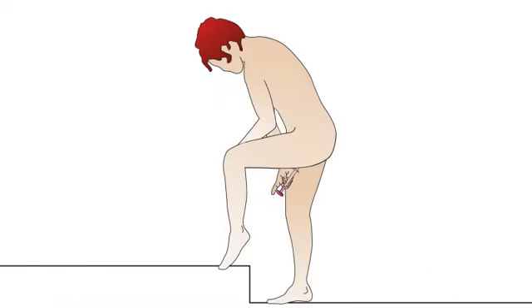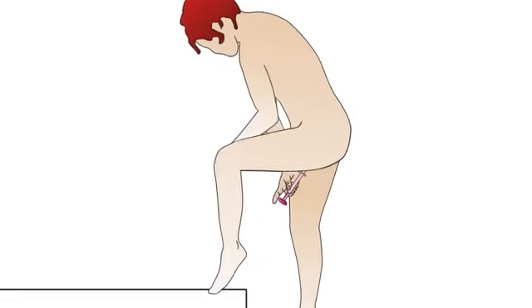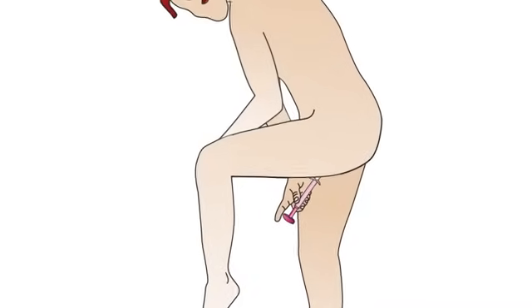Obtain the sample whilst in a standing position. Assume a comfortable stance, for example, as if you were about to insert a tampon.